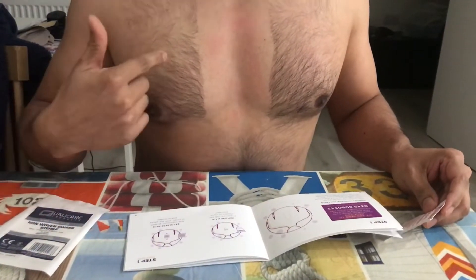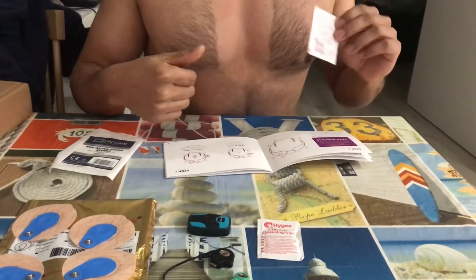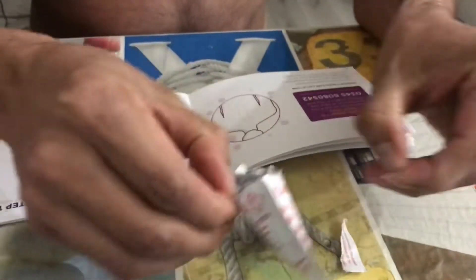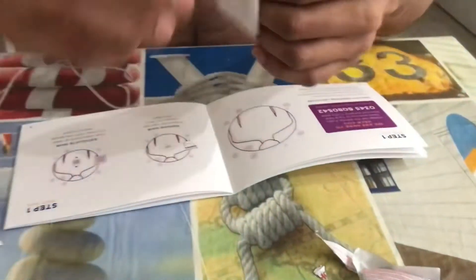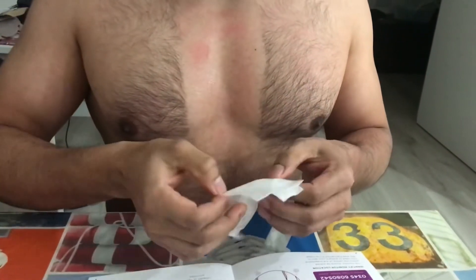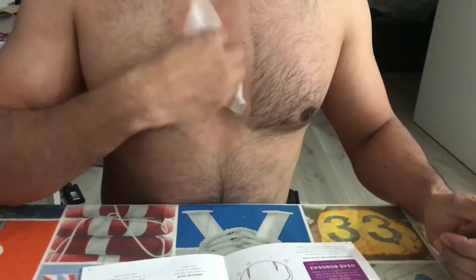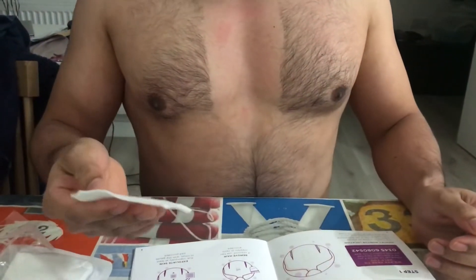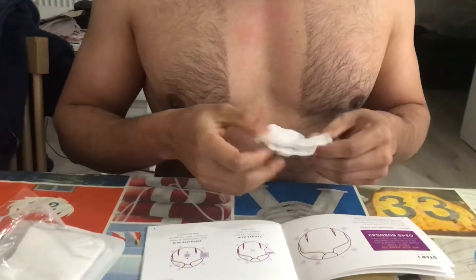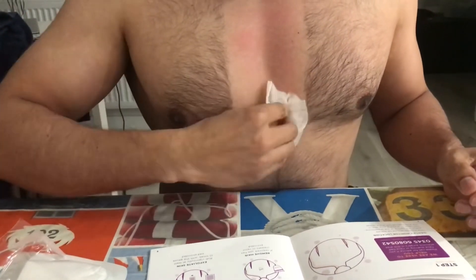Step one is already completed — I cleaned my chest with the razor. I have to say that was a really good razor. Now I'm going to give it a really good clean, then dry it up with this pad, and then show you how to place the electrodes. It's just burning a little. They ask you to clean at least 10 times vigorously, so let's clean and make sure the skin is completely dry, otherwise the electrodes may come off.